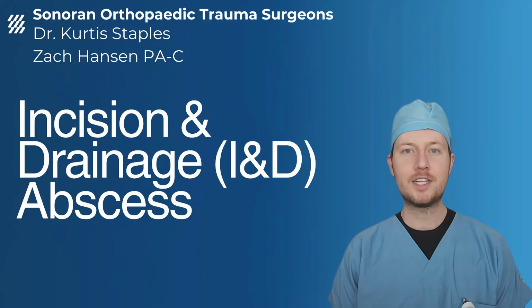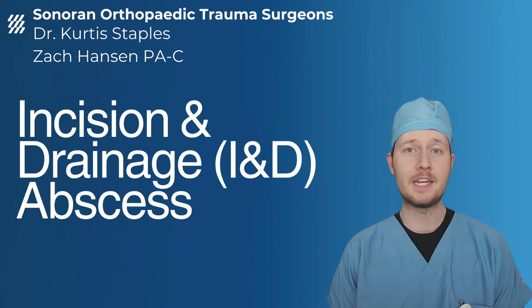I'm a physician assistant working alongside Dr. Kurtis Staples for Sonoran Orthopaedic Trauma Surgeons in Phoenix, Arizona. Today, we are taking you into the OR to show you the direct point of view process of performing an incision and drainage procedure for an infection.